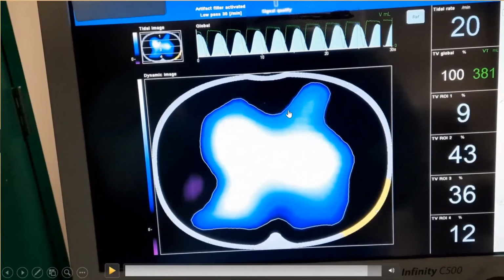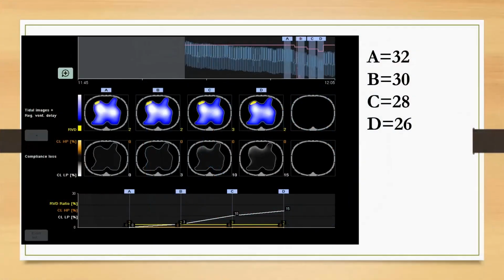As I mentioned in the video, a really, really good result with the proning of the patient. We see the white well distributed all throughout the lung, a little less here. So this patient had a very good result, and we did a study again because we've had tremendous changes in the distribution of ventilation. Did again on APRV, going from 32 down to 26.